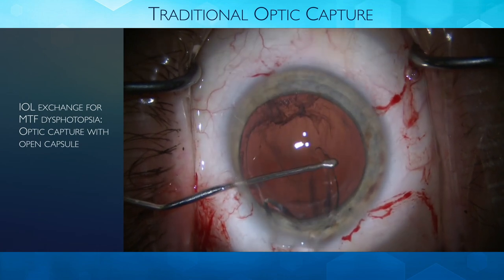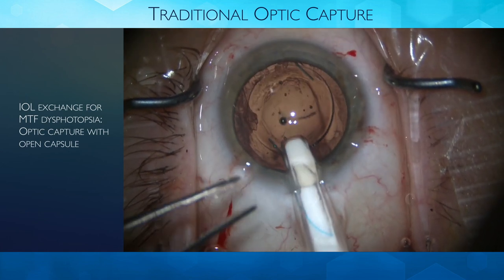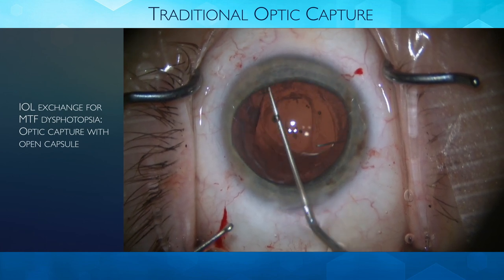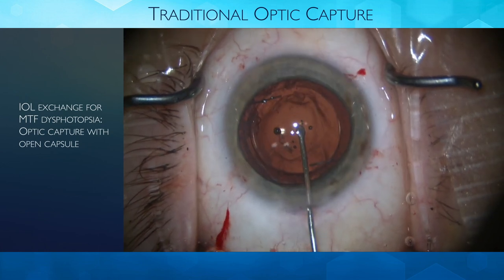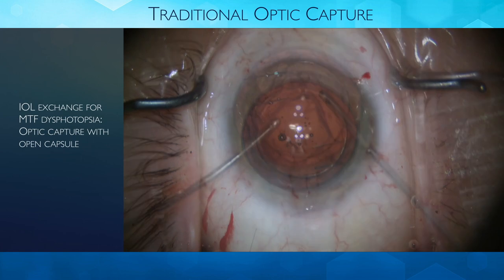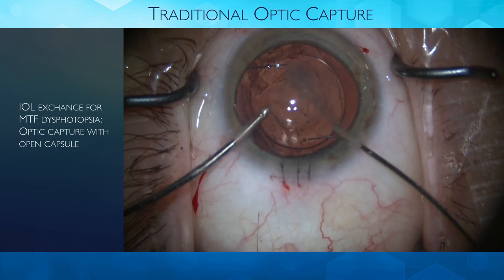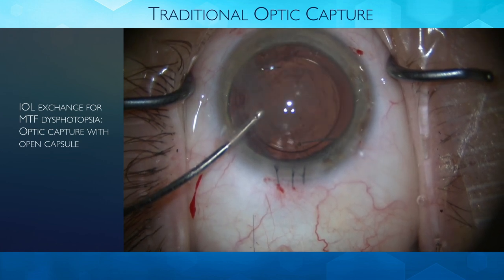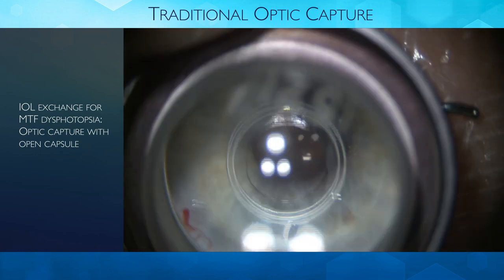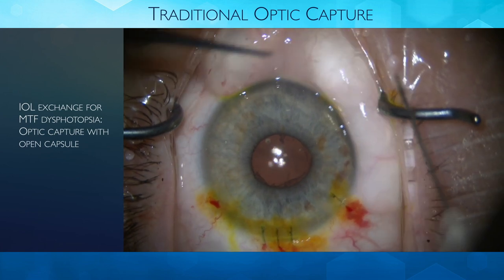Positive dysphotopsia are light streaks and arcs stimulated by temporal light — they are light, not dark shadows. Negative dysphotopsia is a dark shadow. This patient had a multifocal in addition to positive dysphotopsia. We're putting in the LI-61AO Bausch & Lomb silicone lens with zero spherical aberration, placing the haptics in the sulcus and the optic behind the anterior capsule. You need an anterior capsulotomy of 4.5 to 5 millimeters to accommodate optic capture. Use preservative-free triamcinolone to visualize vitreous throughout, then put in a meiotic. Fill every time you come out to prevent vitreous prolapse and avoid hypotony. Finish with subconjunctival dexamethasone for a calm, quiet eye the next day.